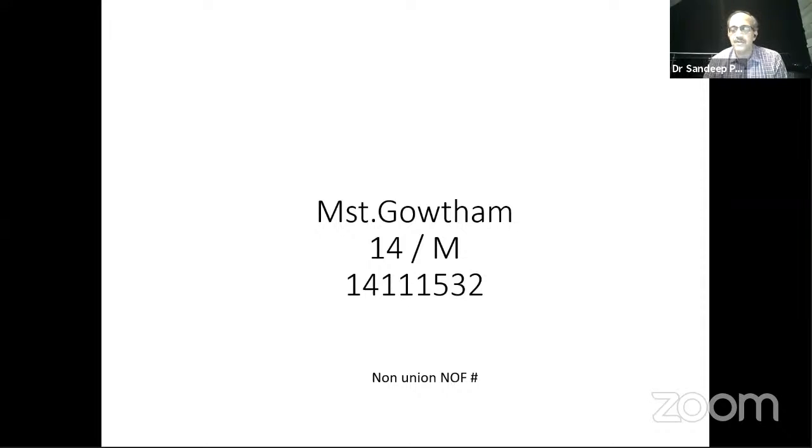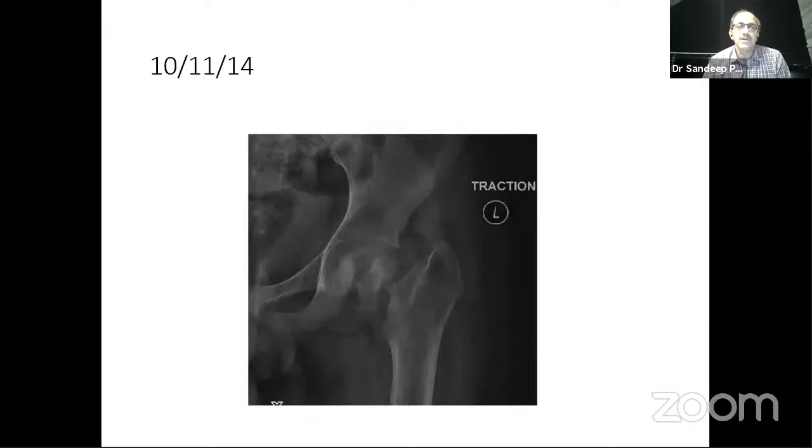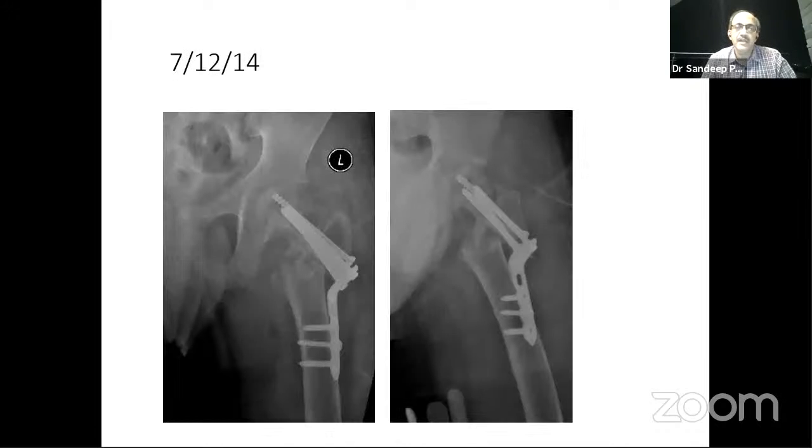This is another case which we had done in Ganga 4 years ago. Venkat will remember, a 14 or 15 year old boy who had a 12 month non-union and the head already showed some sclerotic changes. So again, Dr. Taral and I had done this. This was a traction film. So we did augment the calcar using an inferomedial fibular strut graft, and we did a valgus osteotomy and fixation. Again, no opening of the capsule.